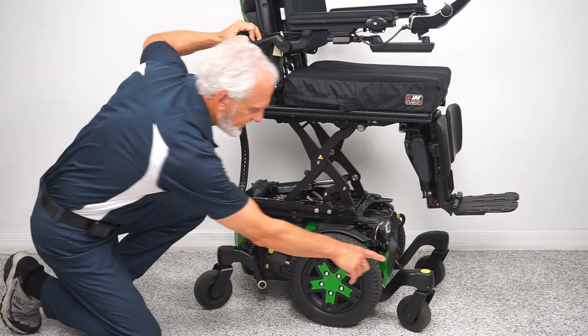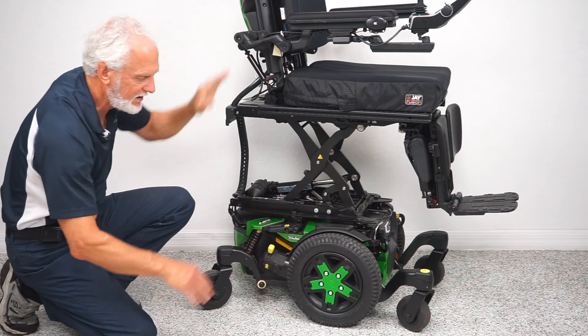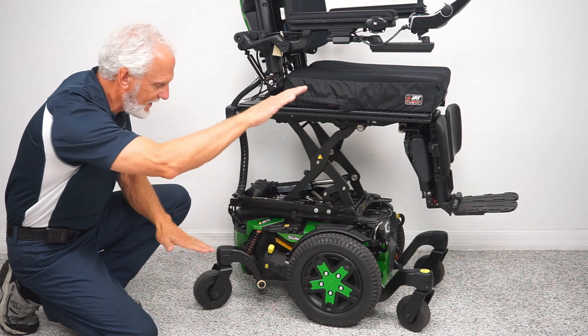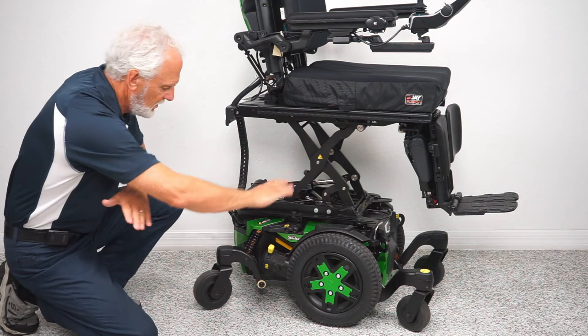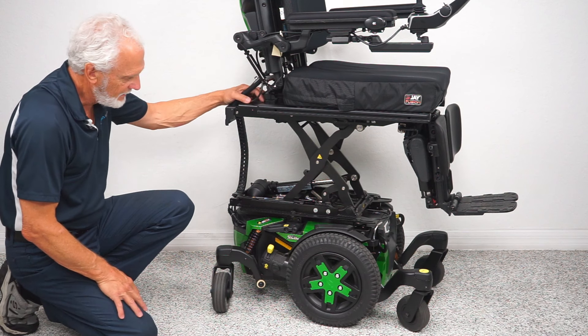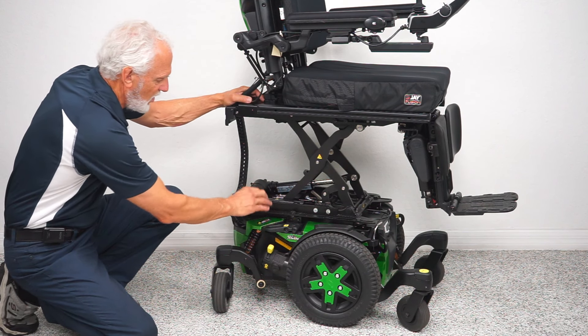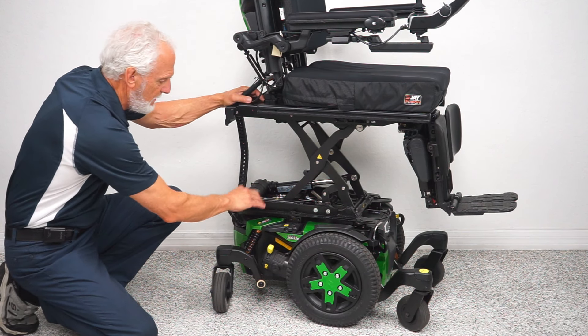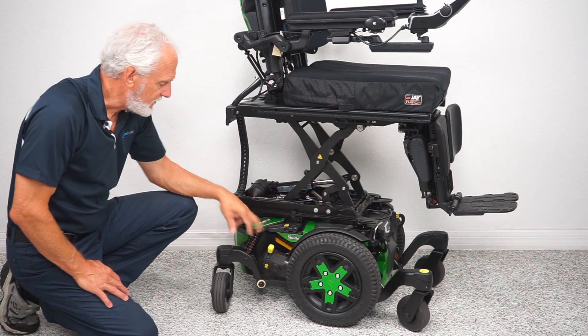When you have a mid-wheel drive, you're always going to have a caster wheel on the ground in front and a caster wheel on the ground in the back to keep that stability. When you turn a circle, these wheels will turn in a circle and that's why you get that nice tight radius. You have anchor points here — all metal construction — four of them around the chair. This is where you secure your chair if you're going to transport it.